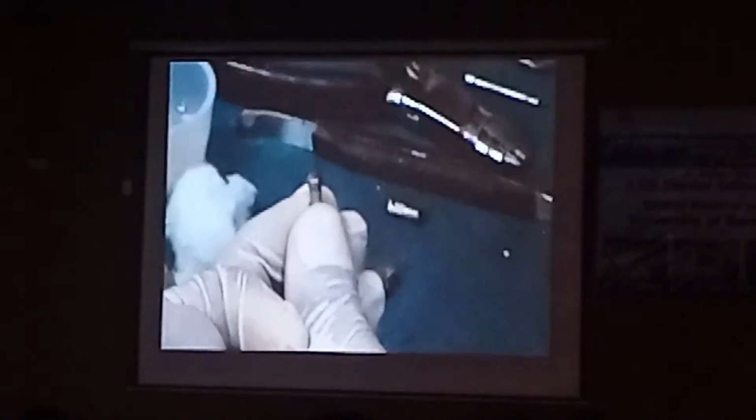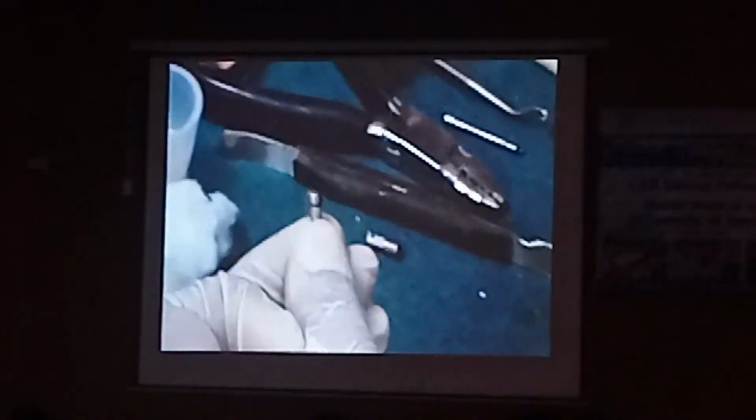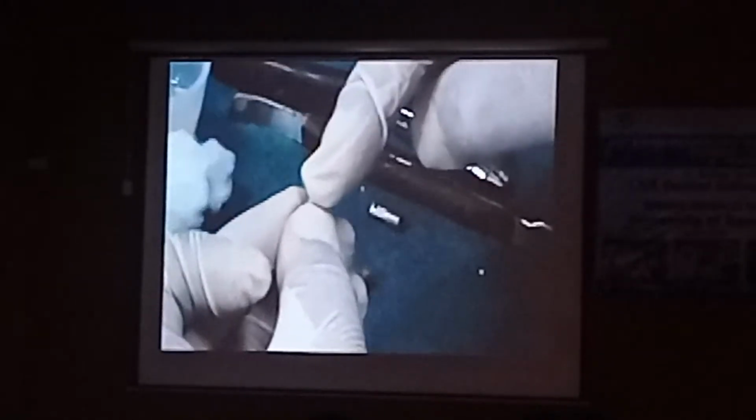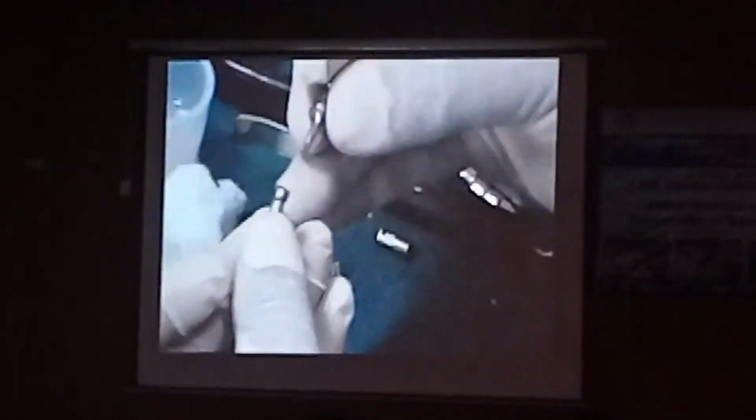Then I can move it into the patient's mouth and maybe whatever is remaining I can customize only that remaining part in the patient's mouth. It is very difficult to customize the whole thing in the patient's mouth because some of that initial composite might fall into the implant also or into the socket also. So always do the initial contouring here by roughening it and then do the final contouring as required in the mouth. And you can use the analog to hold it, right?